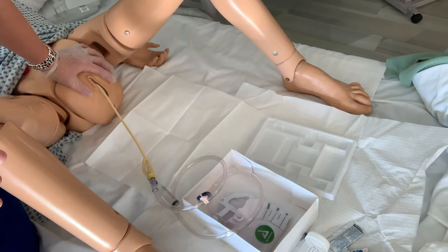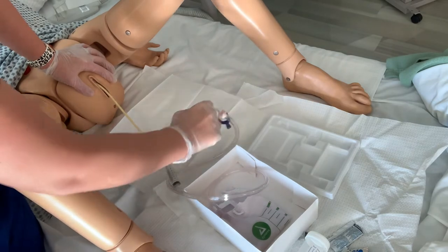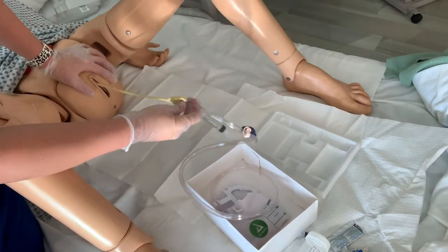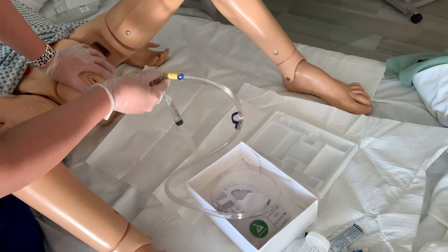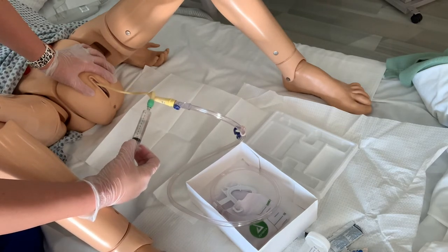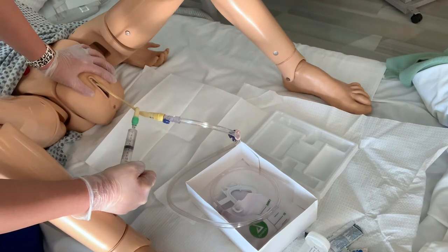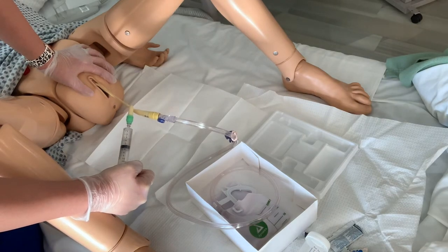At this point, we're going to pretend urine is flowing in the bag. We're going to slowly inflate the balloon. We can always look on the catheter kit for the balloon size — this is a 14 French catheter and the balloon is 5 mils. We don't ever want to put more water into the balloon than what it holds, so I'm only going to put 5 mils in with my 10 mil syringe. If our patient feels an astounding amount of pain, that would mean we're trying to inflate the balloon in the middle of the urethra. If that were the case, we would deflate the balloon, advance it a little more until it's in the bladder, and then try to re-inflate.